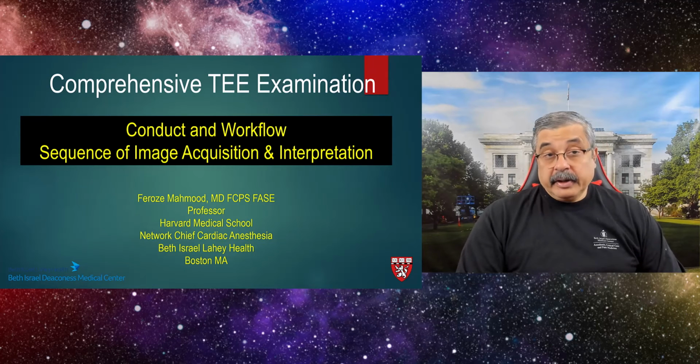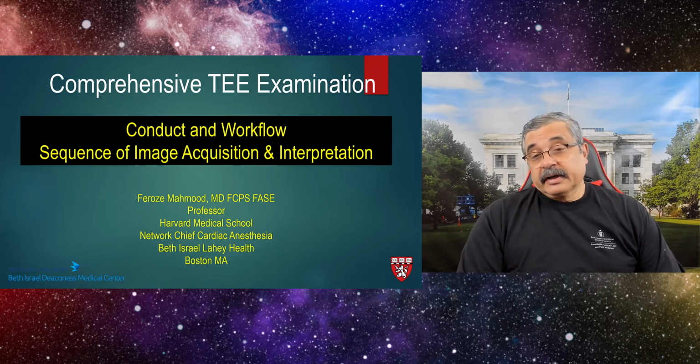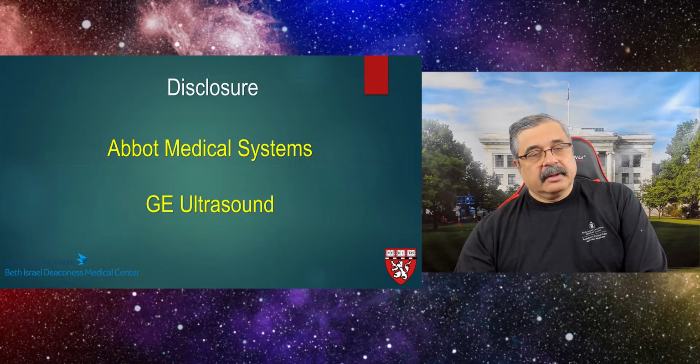In this How I Do It series, we are going to go over the comprehensive transesophageal echocardiographic examination and also on the conduct and its workflow, but more specifically, we are going to go over the sequence of image acquisition and interpretation. These are my disclosures.